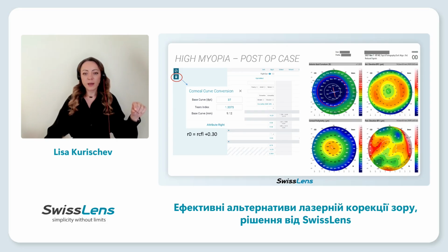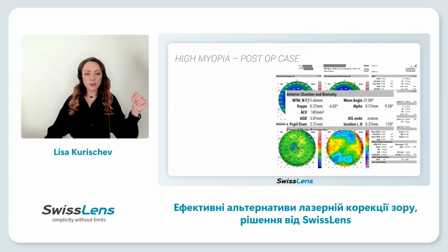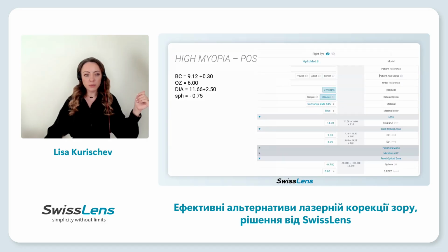That's all. And what we also need is the diameter, of course, of the LASIK zone. And you can measure it like this. I show you. Normally, it's something between 6 and 7 millimeter, but you can always measure it. Okay, to complete our calculation, we need the diameter of the lens. So how to do it? Here we have our cornea diameter and we add 2.5. And here we are, we have all data we need.